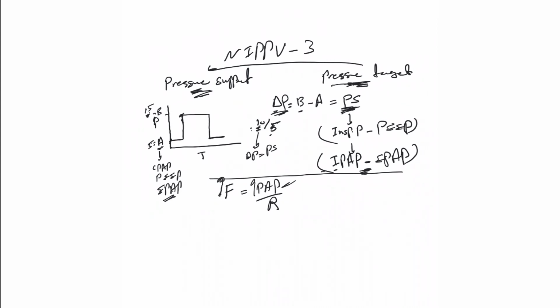And the higher the flow, the higher the tidal volume, which means better ventilation. So if you want to ventilate the patients, then you play with this. While for oxygenation, we said we have these values to play with. Remember that, please. To ventilate, to give more or less tidal volume, play with the delta P, while for oxygenation, you play with these values.